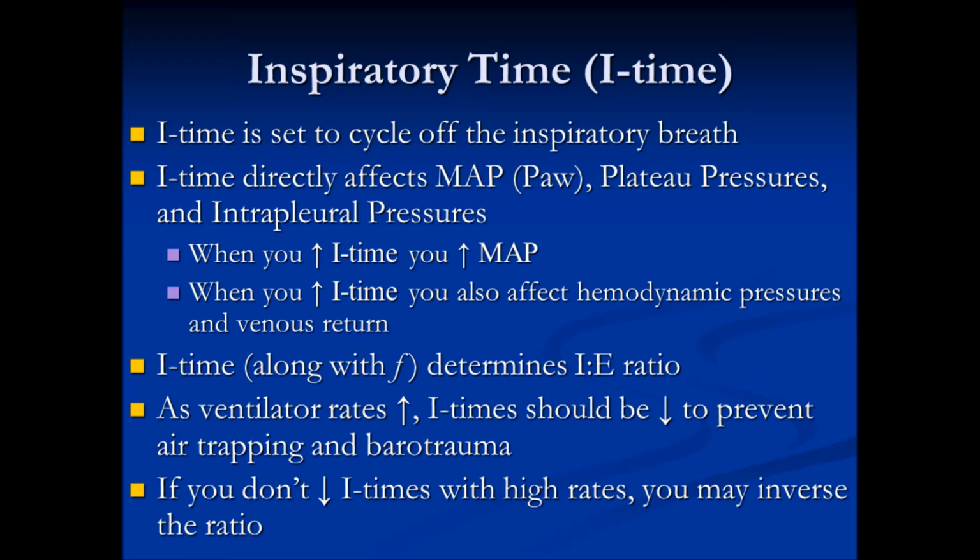As ventilator rates increase, I times should decrease. Very important concept to understand, because if you're not mindful of the amount of time you have set for I time, if you have a vent where you can manipulate the rate as well as manipulating I time and E time, then this could cause you to have air trapping.